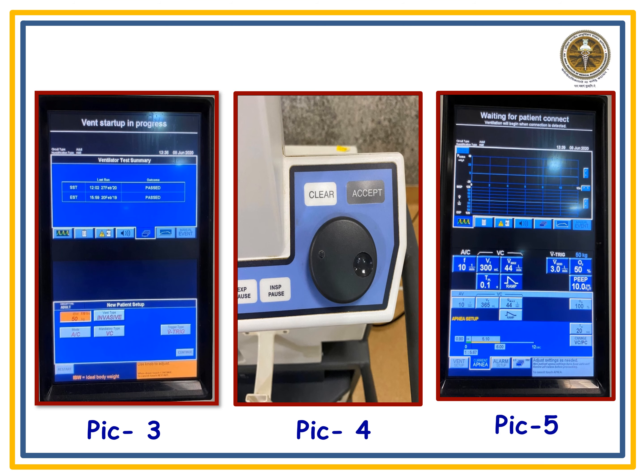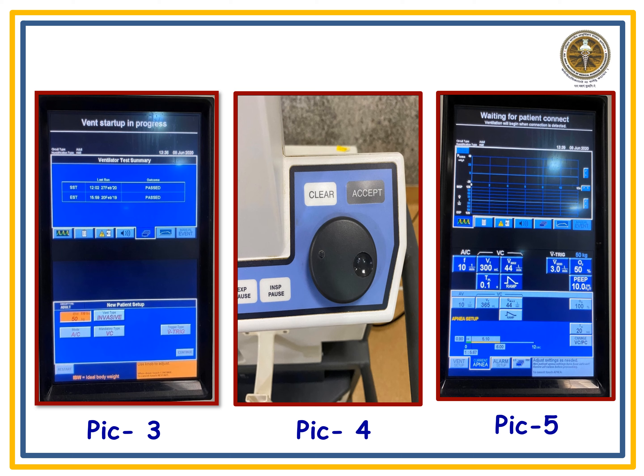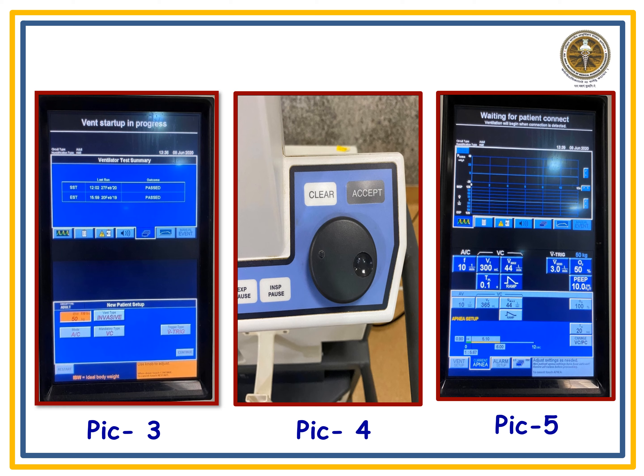The finalized settings will appear on the ventilator screen. The ventilator will then display a message on the top of the screen indicating that it is waiting for the patient to get connected.